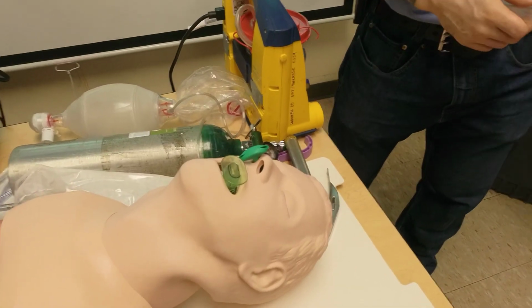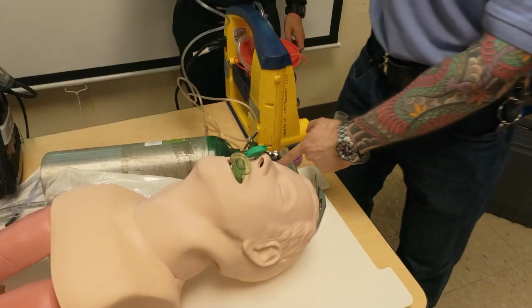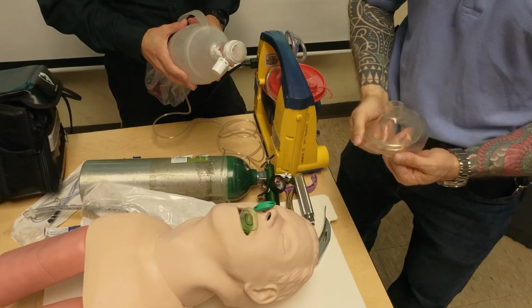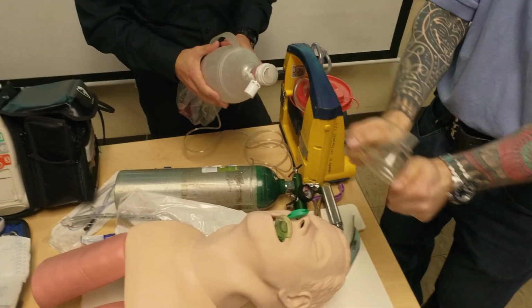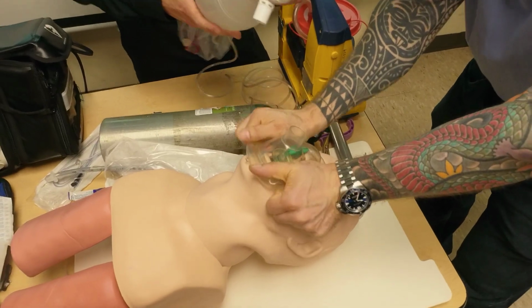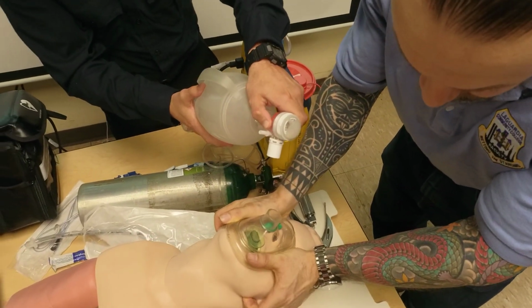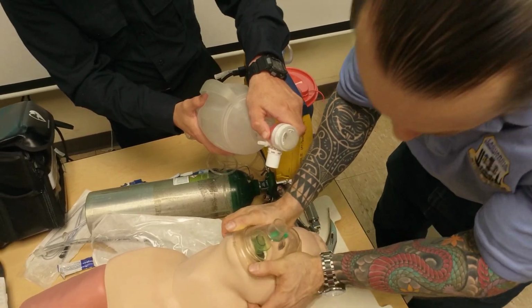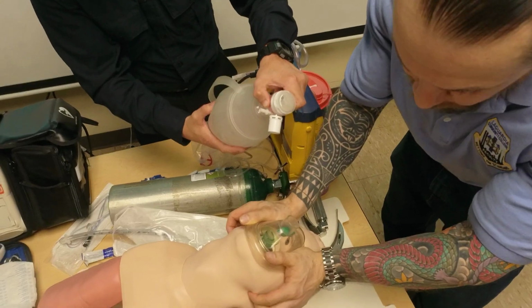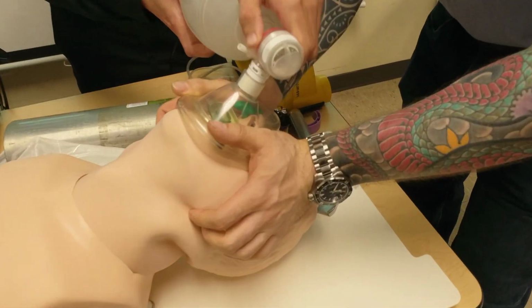The next thing I'm going to do is initiate my BLS procedures. Since you're over here, come to the side. You're going to be the person squeezing the bag. I connect it to high-concentration O2 and turn it on to 15 liters of oxygen. This is the technique I'm going to show you. You spread the cuffs, put the mask on the bridge of the nose, and get a good seal. I then find my ascending ramus, lift it, and extend the head over the atlanto-occipital joint. Here's the trick so that your hands don't tire out: I'm going to engage on 5, and he's going to squeeze on 6.